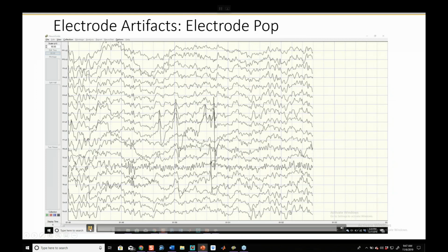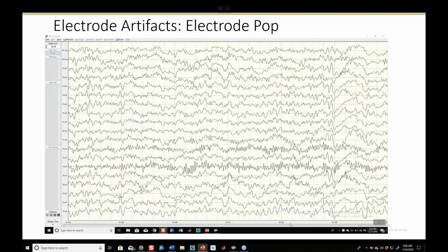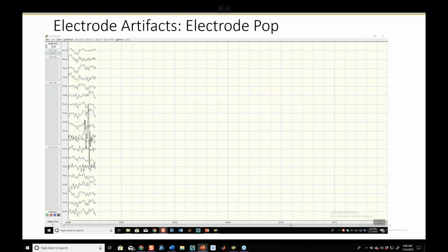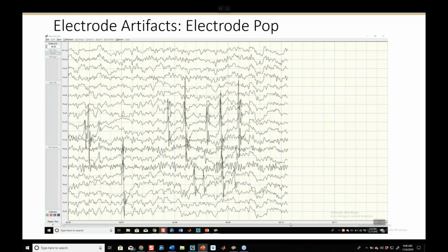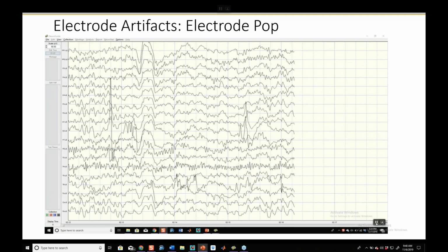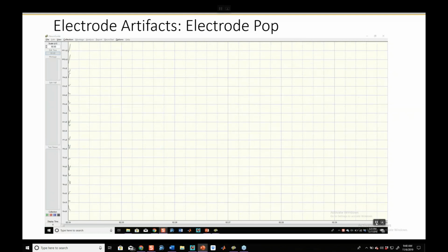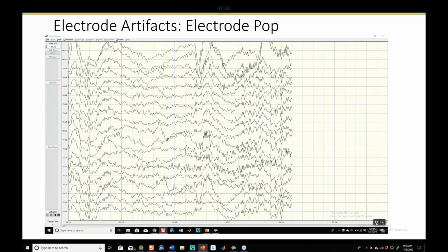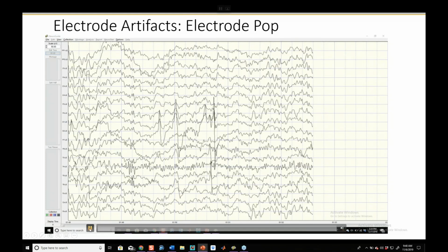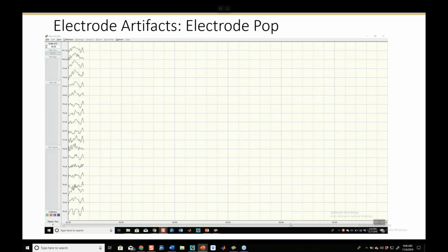Here's another record that is a sneaky one, electrode pops. So a pop and a loose electrode, they're certainly in the same family. Oh, there it goes. Whoa. O2 is really doing its own thing. Whoa, whoa, whoa. Right. And so, yeah, as a clinician, your first thought, especially if you're not super familiar with raw data, is you may say, oh my goodness, do we have a seizure here on our hands, right? We have this loose popping electrode. And you don't. That's the good news. You don't have somebody that's showing any epileptiform discharge. That has field and phase, right? That's multiple electrodes doing the same thing.